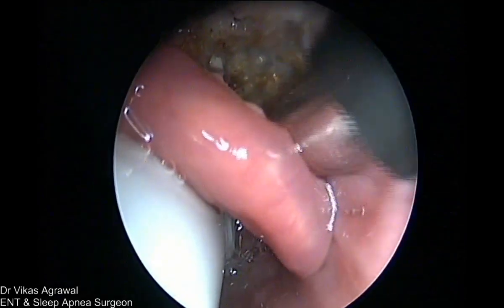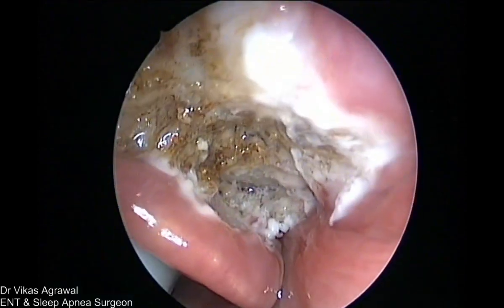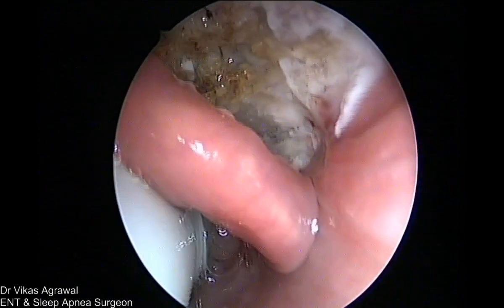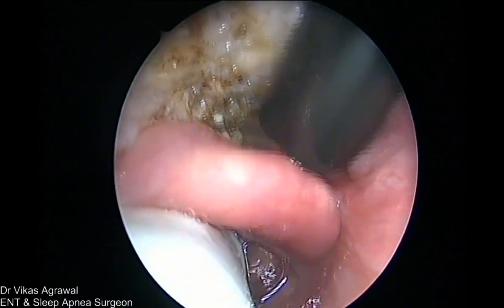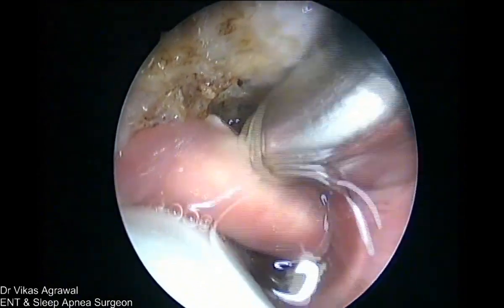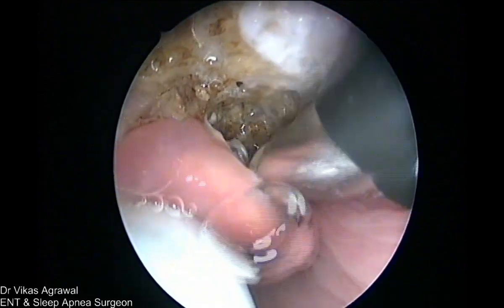I am right at the median glossoepiglottic ligament, and I am coagulating it. I am not ablating there. So it's all raw, and there's all muscle. Can you see that? This is full muscle. I have reached the muscle, removed all the lymphoid tissue, and removed this mucosa without any bleeding. So this will cause a good glossoepiglottopexy.